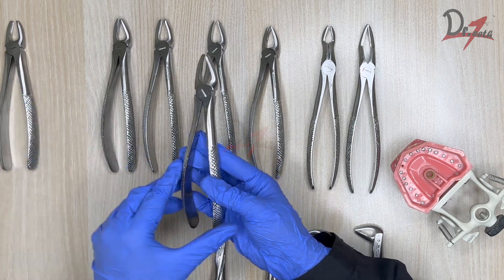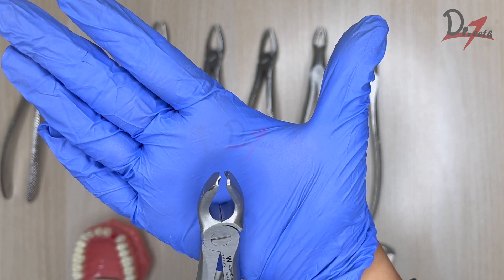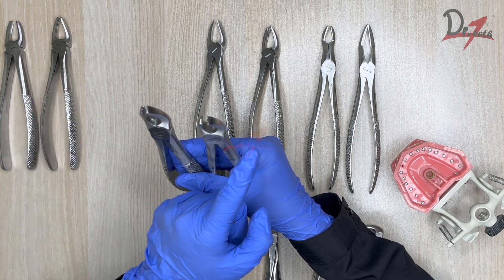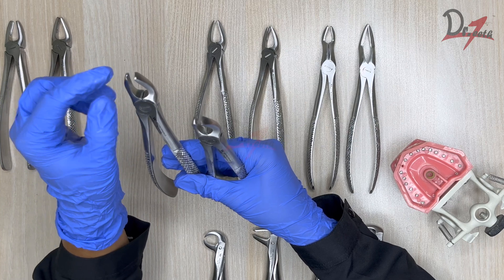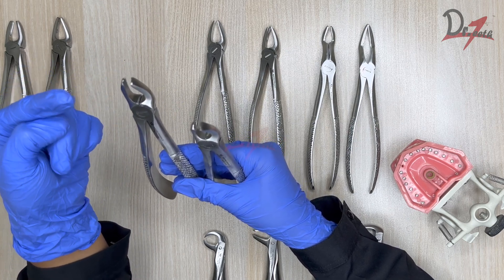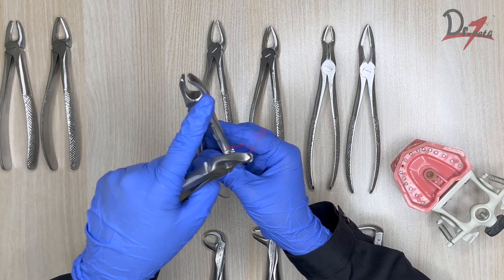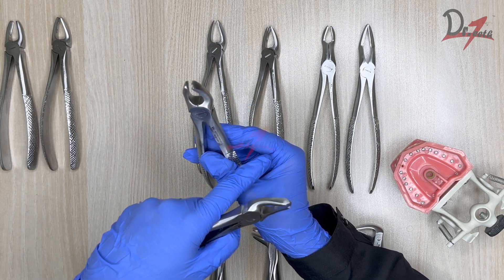Here we have two molar forceps — one for the right and one for the left quadrant. To identify which is for which side, look at the beak. This pointed surface faces the left side on one, and the right side on the other. For the upper molars we have two buccal roots and one palatal root. The pointed beak engages between the two buccal roots. This one is for the first quadrant, and the other — where the pointed beak is on the opposite side — is for the second quadrant.